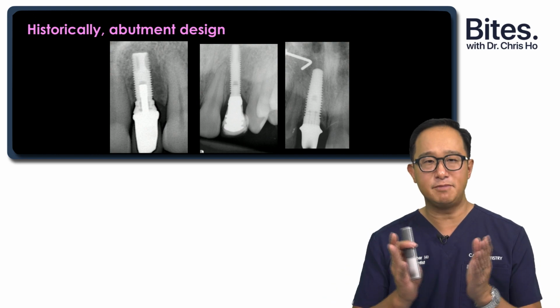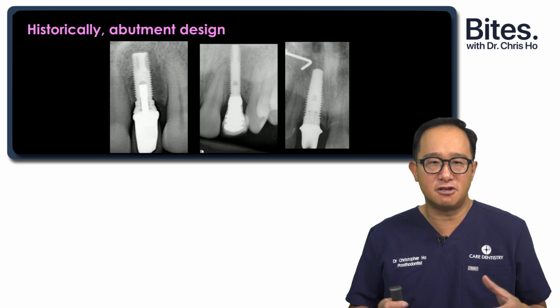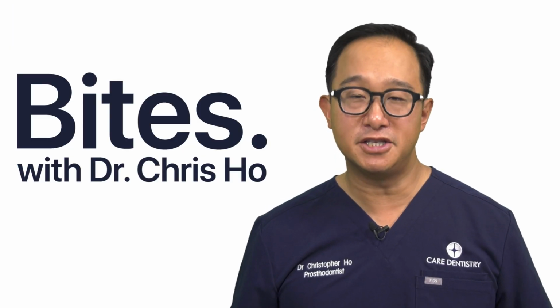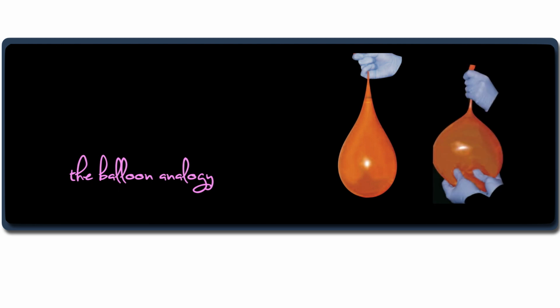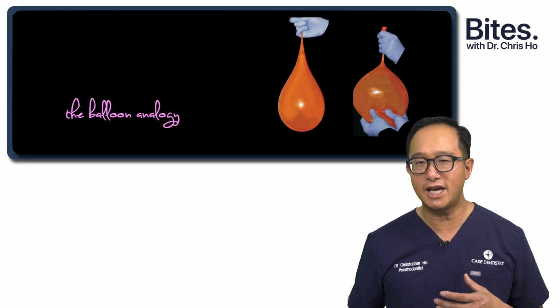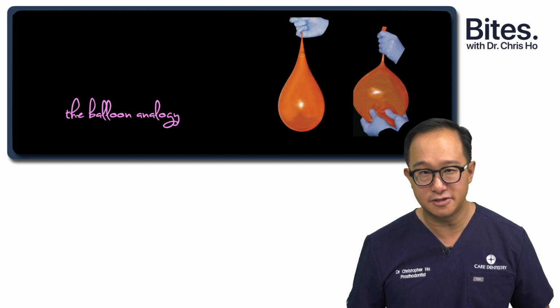We used to flare the abutments out from the actual implant and, in a way, compress the soft tissue. The peri-implant tissues are much like this balloon full of water. When you place pressure on this soft tissue, that soft tissue can be displaced to another position. So we can influence our soft tissue by our implant restoration contours.